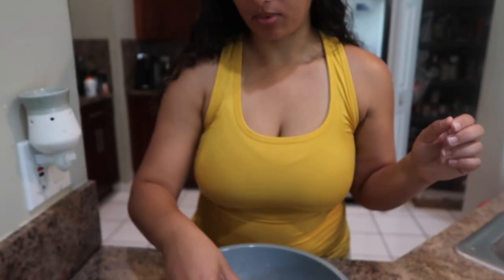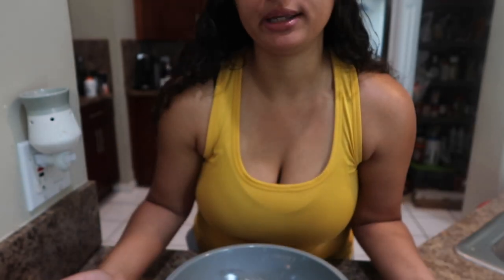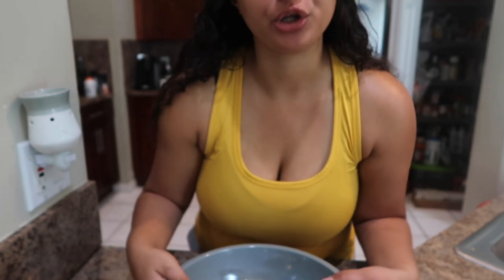I'm gonna put everything into this bowl to clean, and then I'm gonna put some hot water and soap in it, and I can wash it using the brush. As you saw, it was really easy to take apart the breast pump, which is nice because when you're cleaning them, you want something that is quick and easy to go ahead and clean after you pump.